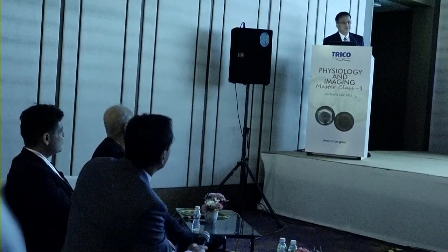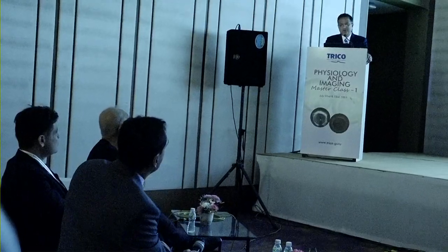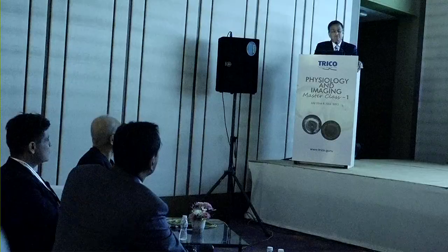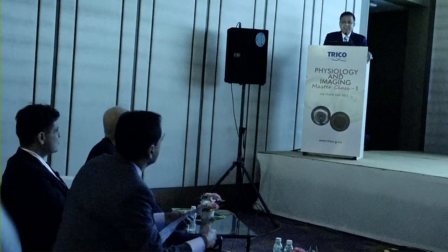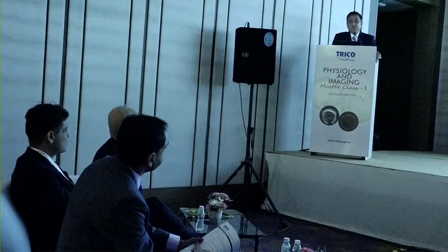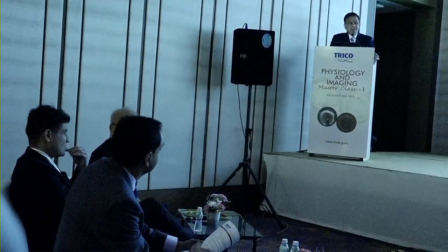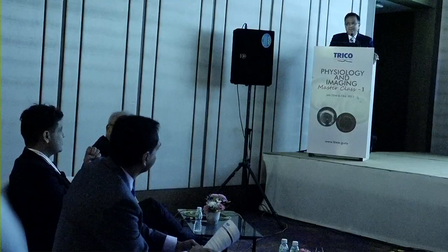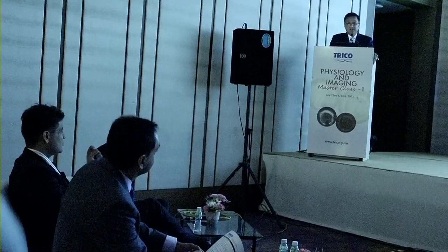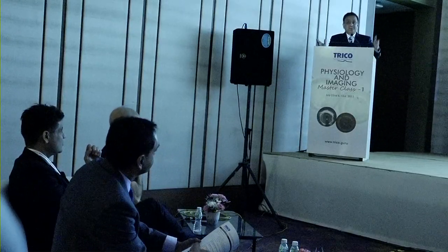You're absolutely right, there is data on areas of 5.5, so minimal stent area of 5.5, as a predictor of very good stent outcomes. And in my lab, I use either one of those schools of thought by convenience. So if in a negatively remodeled area I have an area of 5.5 millimeters squared, I'm going to stop, even though it's 70% of my reference lumen area. And again, that comes to using your head.